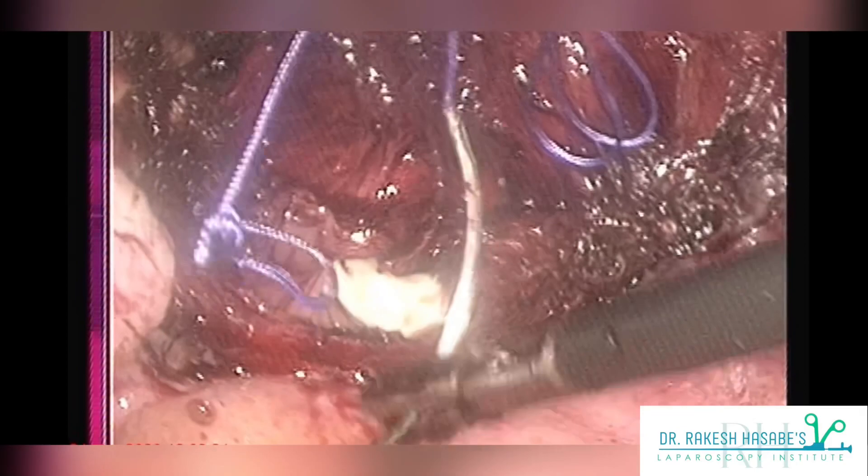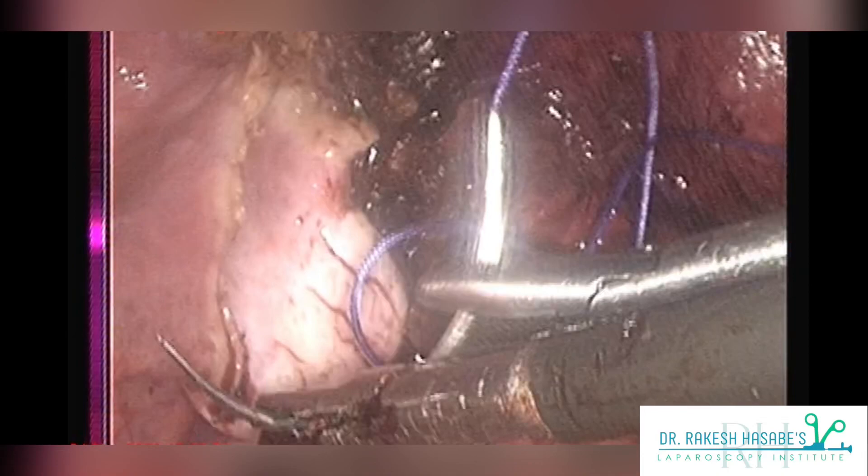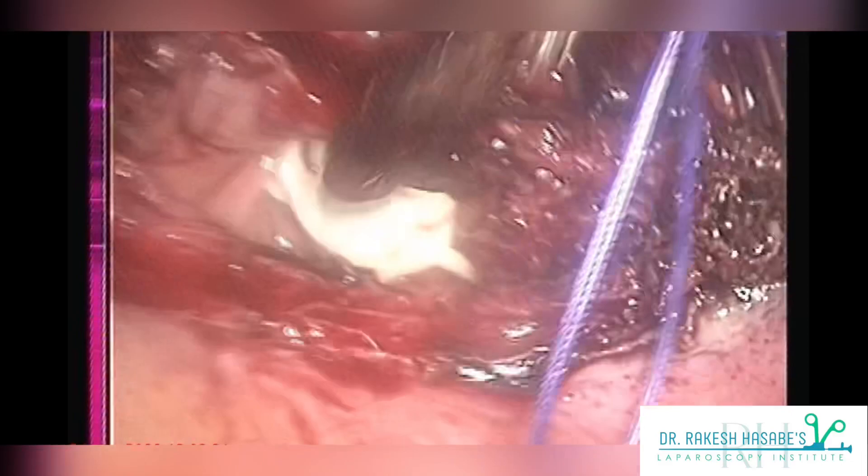Now comes the most important part: grasping the needle. Always remember it is a two-step technique — catch hold of the tip of the needle and hold your needle at the two-third one-third junction. Entire suturing should be performed by a swift action of your wrist joint.